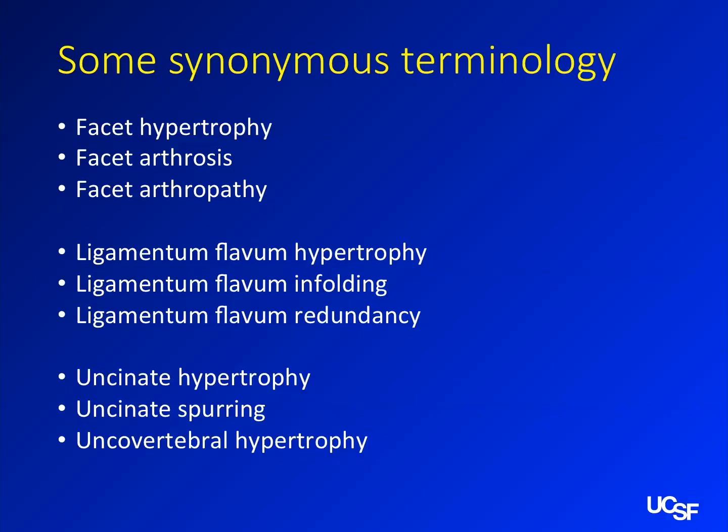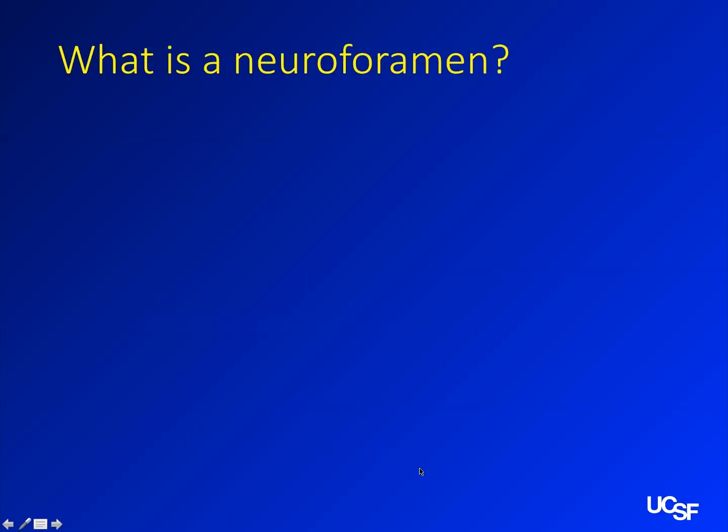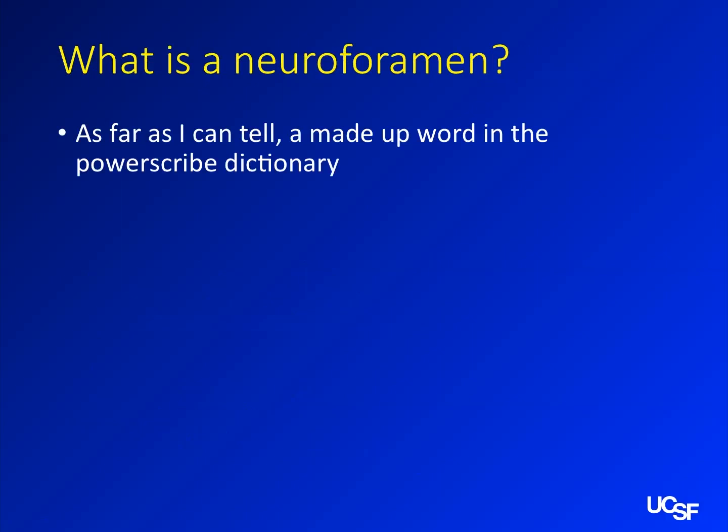Uncinate hypertrophy, uncinate spurring, uncovertebral hypertrophy — these all mean the same thing. They're all referring to growth of those uncinate processes that are causing some narrowing. As for 'neuroforamen' — as far as I can tell that's a made-up word from PowerScribe. If you want to be technically correct, it's 'neural foramen.' Neuroforamen makes it sound like there's a nerve with holes in it.